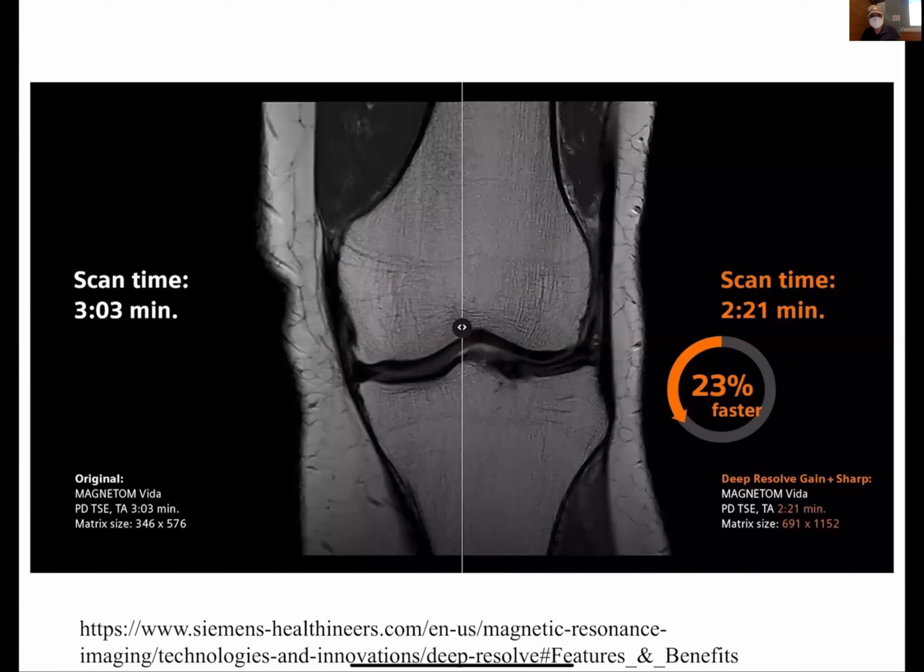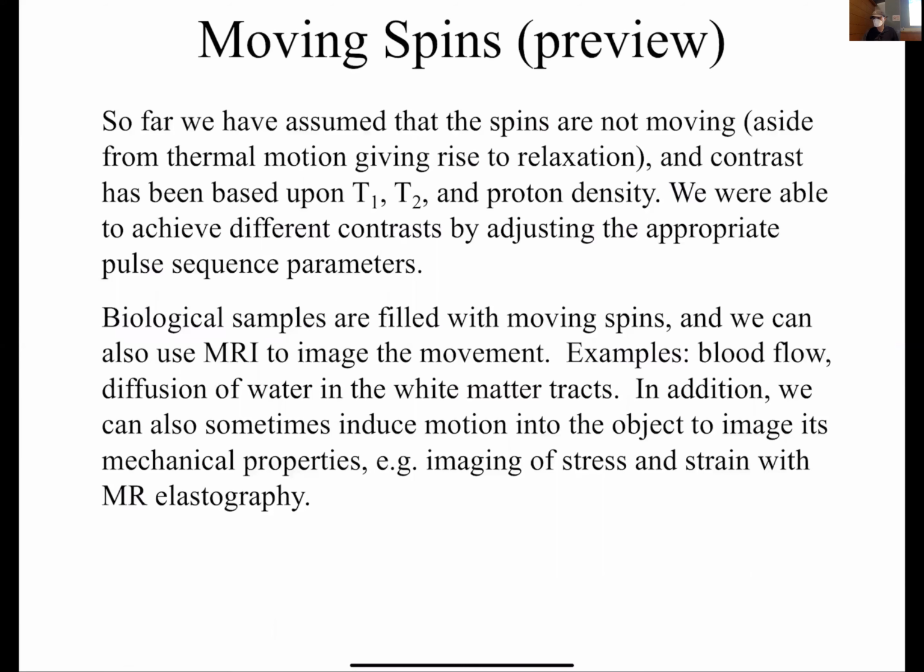Okay. If there are no questions, then let me just go through the part on diffusion MRI. So we're going to start it today, and we'll do a little more on Wednesday. This is probably one of the more important variants of MRI that's being used both in research and clinically. So I think it's good to give you a sense of this, because the likelihood that you will have this scan done sometime in your life, on yourself or someone you know, is pretty high. So it's good to know what these different scans do.